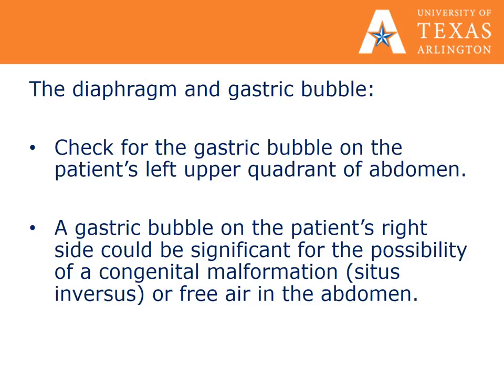It is important to note what side of the body the gastric bubble is on. It should be seen on the patient's left upper quadrant of the abdomen. A gastric bubble on the patient's right upper quadrant should raise concern for congenital malformation such as situs inversus or free air in the abdomen.